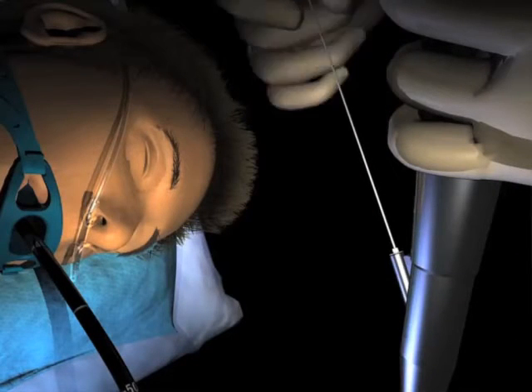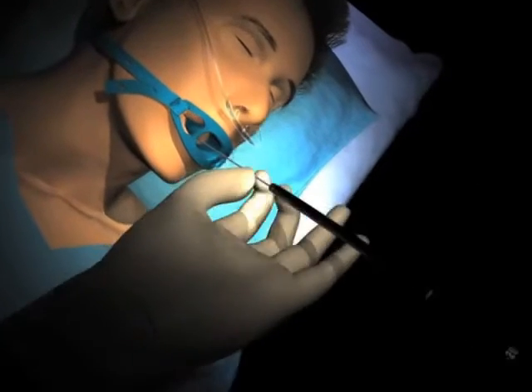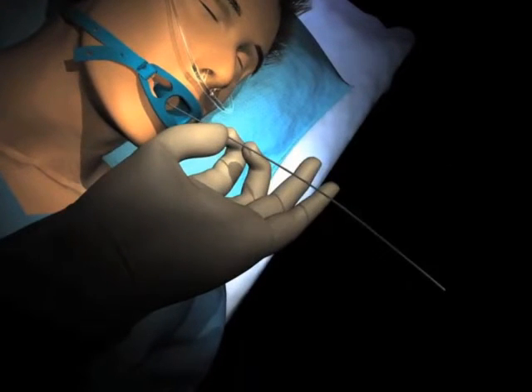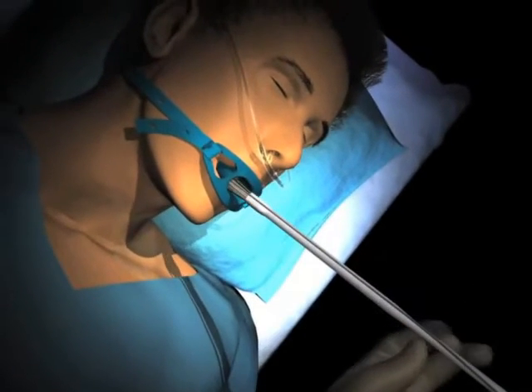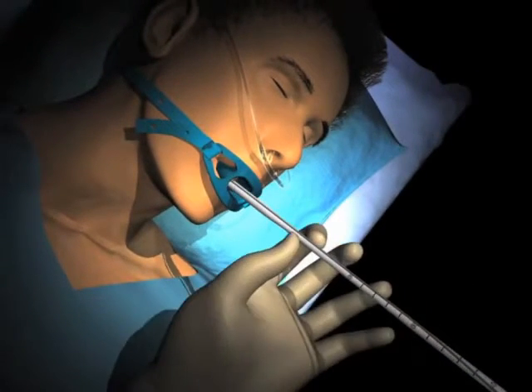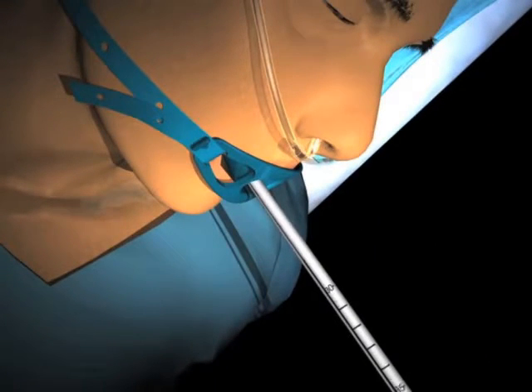30. Insert the guide wire through the endoscope into the pylorus. 31. Then remove the endoscope, leaving the guide wire in place. Thread the proximal end of the guide wire through the tip of the catheter. With the generator in the ready mode, the catheter is advanced down the guide wire to a position 1 cm above the Z-line for treatment level 1. Placement is confirmed versus the bite block.